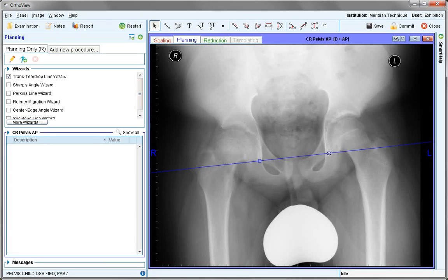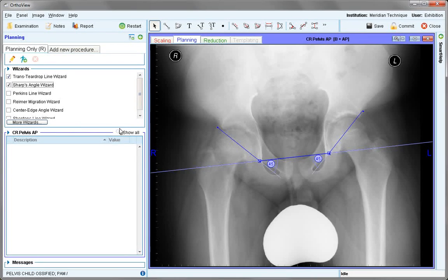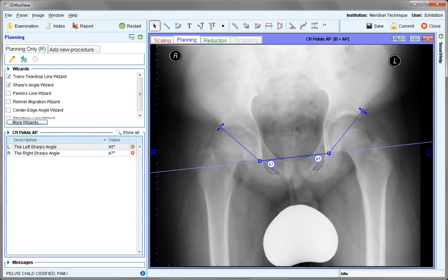The next wizard uses a common set of reference points. It positions one end on the teardrop and then on the lateral part of the acetabulum as shown, and it needs to be manually positioned. Values appear and are also recorded in the planning panel.